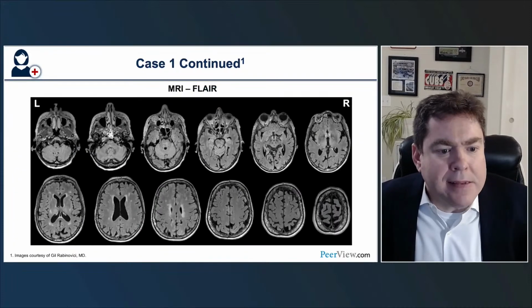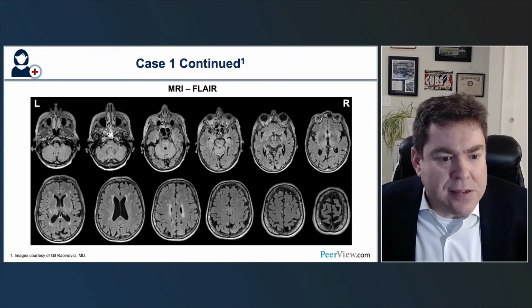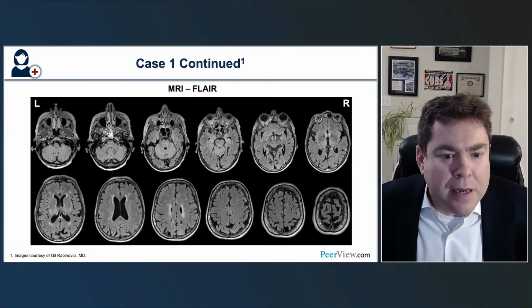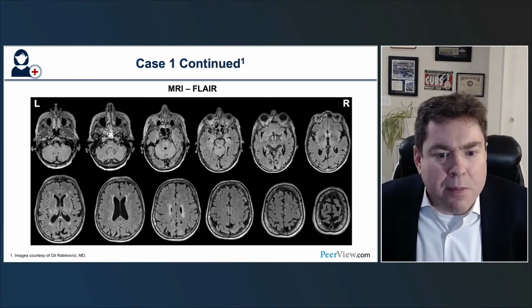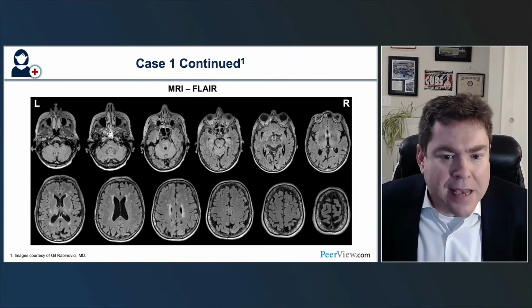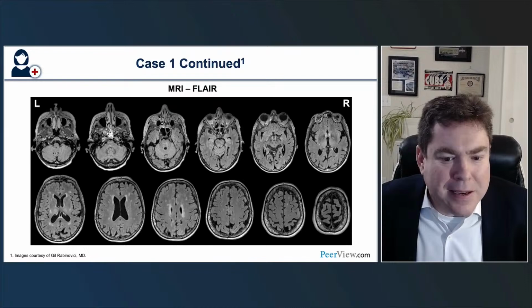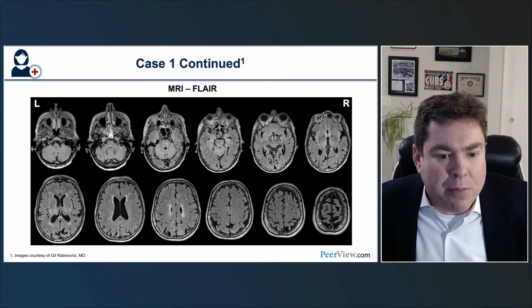This is her brain MRI scan shown in neurologic orientation. These are axial FLAIR images. You can see that the MRI is pretty unremarkable for age. There may be a little bit of medial temporal atrophy on the right, but I would say not outside the normal range for a 78-year-old, and maybe some prominent sulci in the posterior parts of the brain, but nothing that's really easy to call as abnormal for age. And similarly, some evidence of white matter hyperintensities in the periventricular and subcortical regions, but difficult to call this abnormal for age.